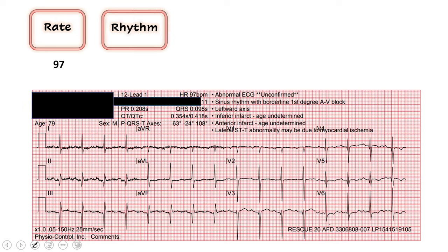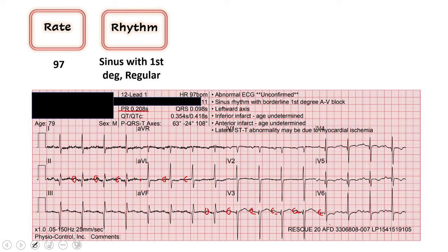As we move on to assess our rhythm, we ask: is there a P wave before every QRS and is this rhythm regular? I do see a P wave. We look in lead two and I follow that out. There's a P wave before every QRS. Here, a little hard to see, but I look down here and I can see P waves as they march out. This one kind of stands out to me because it looks a little bit long, but I do see P waves all the way out. I'm going to look at our PR here — let the computer do the work. The PR is greater than 200, and so this counts as a first degree AV block, but it's still regular. There's still a P wave before every QRS, and so we have a first degree AV block. That's the first thing we found.